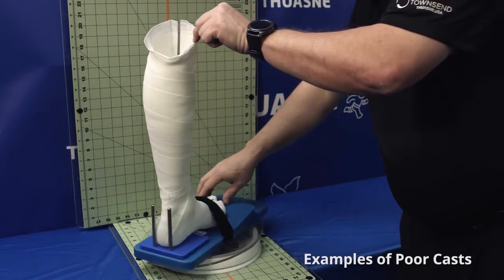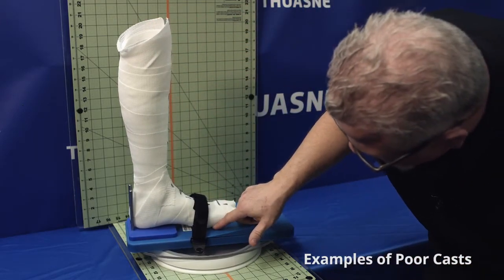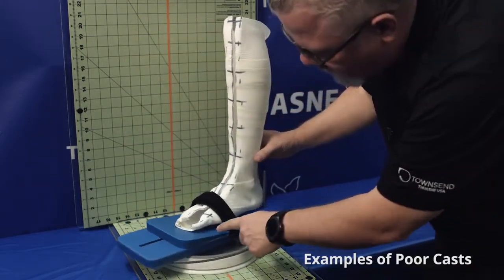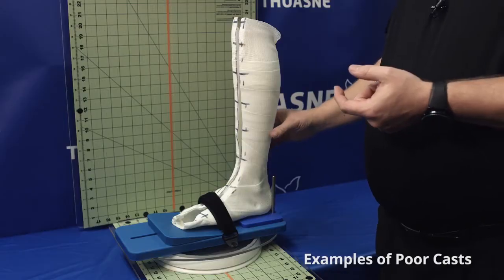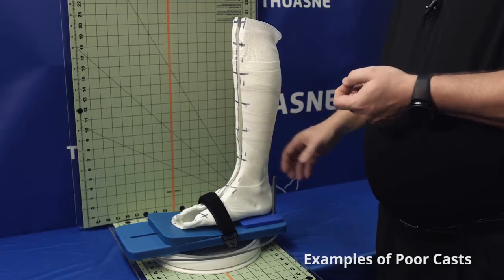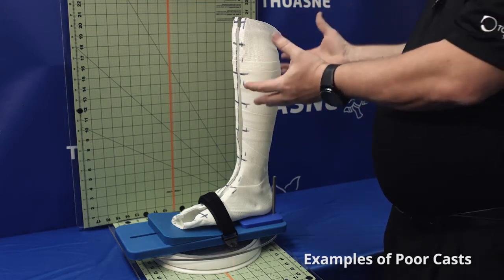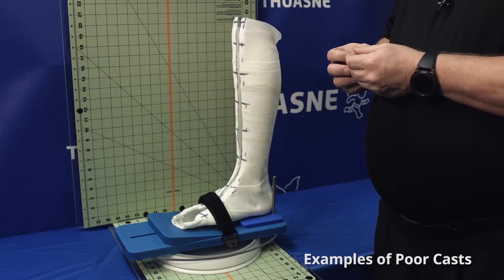When we spin around, we'll take a look at the forefoot. We do have contact with the first met, which is good, but when we spin around and look at the fifth met, there's a significant gap, which means this forefoot is in a significant amount of pronation, and that's going to require a major correction. So this would be an example of a cast that we would have to fail again and then ask for a recast.